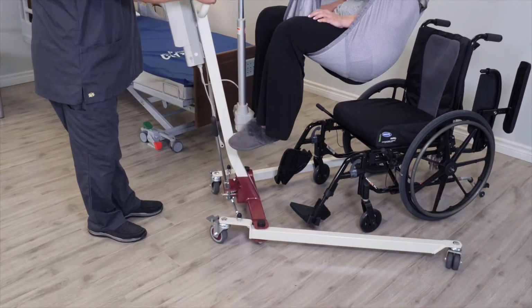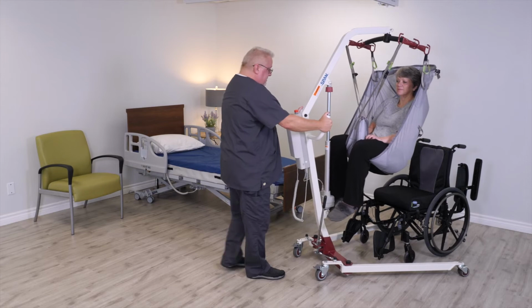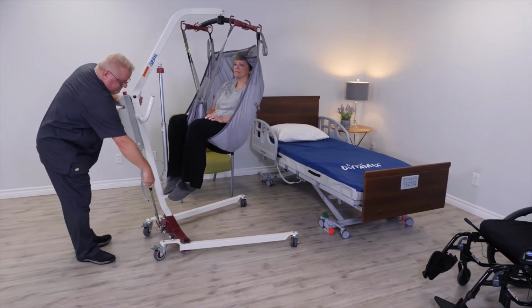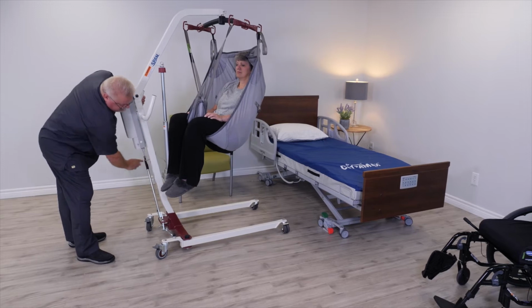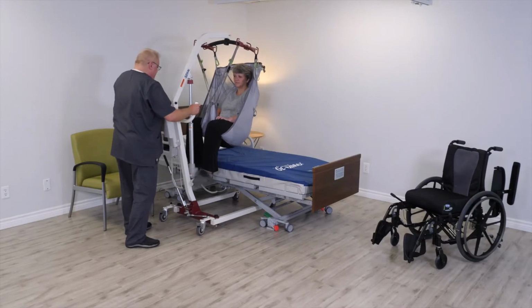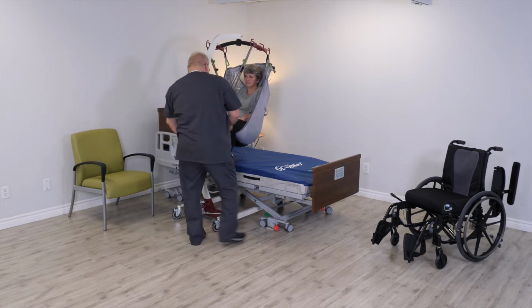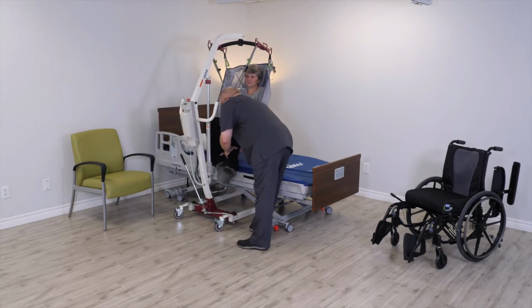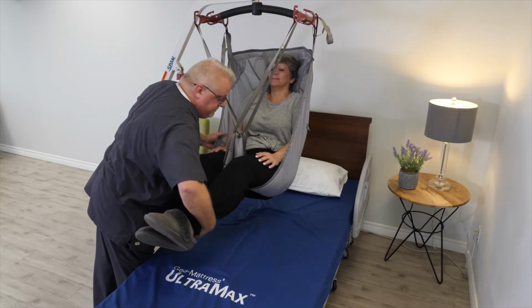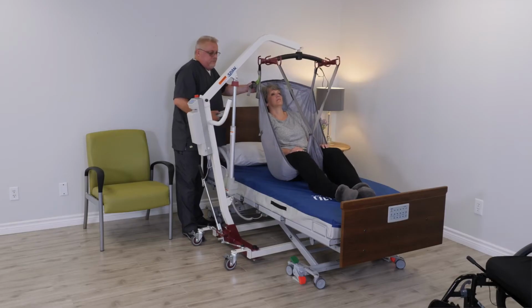Unlock the casters and maneuver the lift towards the bed. Close the base back down. Position the patient over the bed. Leave the casters unlocked for precise positioning, and begin lowering the patient to the surface of the bed.